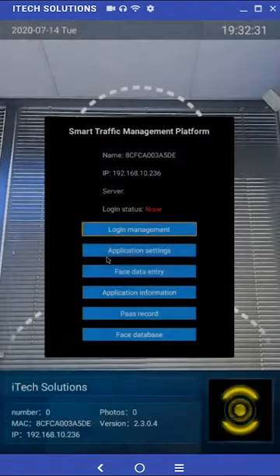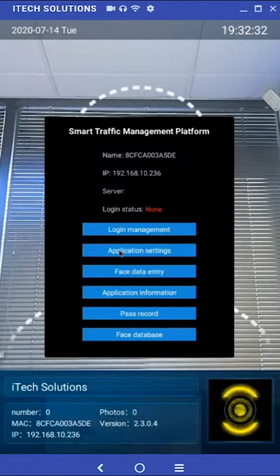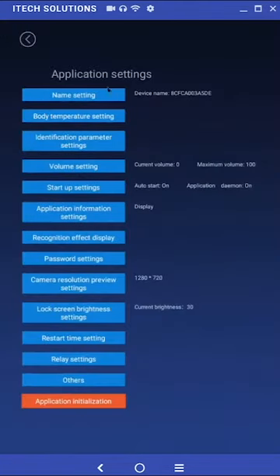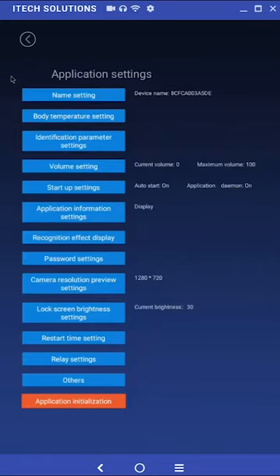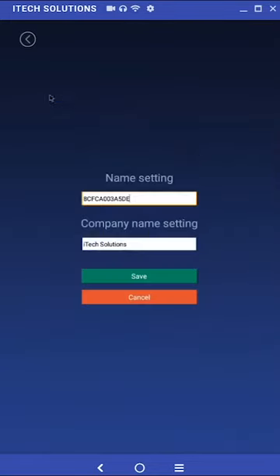Please note that while we will be covering the application settings, we will not be giving specific settings that should be applied. In the application settings sub-menu, we have device name setting. By default, the device name is the Mac address.